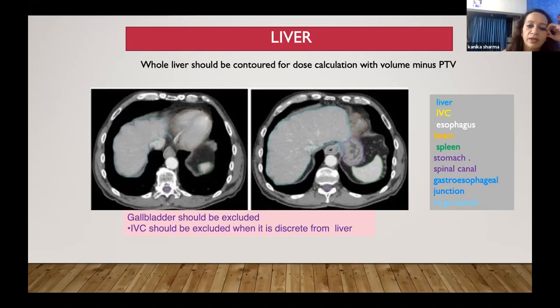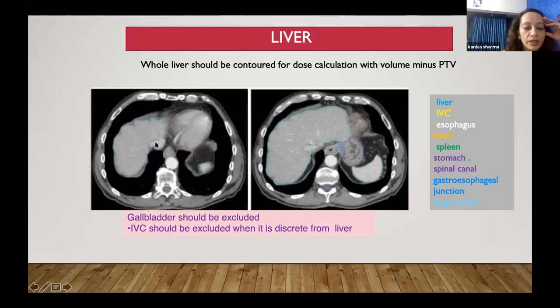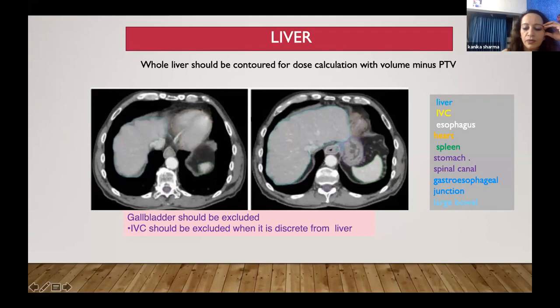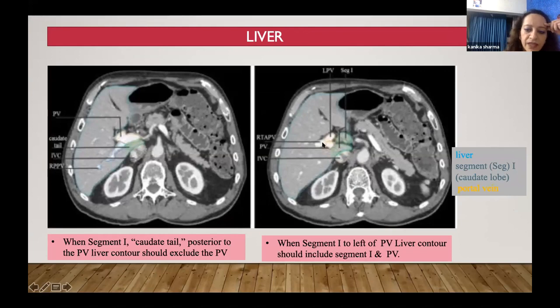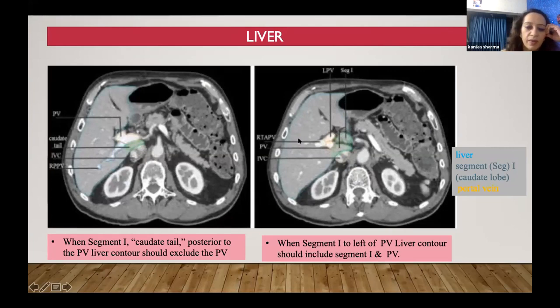When contouring liver for hepatobiliary malignancy, do not include the gallbladder in the liver. Do not include the IVC once it has exited from the parenchyma of the liver. Pay attention to the portal vein: the caudate lobe is the thumb inside your fist. When the caudate lobe is posterior to the portal vein, do not include the portal vein in the liver parenchyma. But once the caudate lobe has come in medially and segment 1 is visible, then your portal vein should be incorporated within the liver parenchyma.